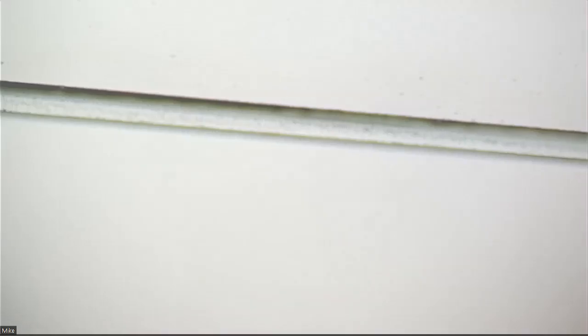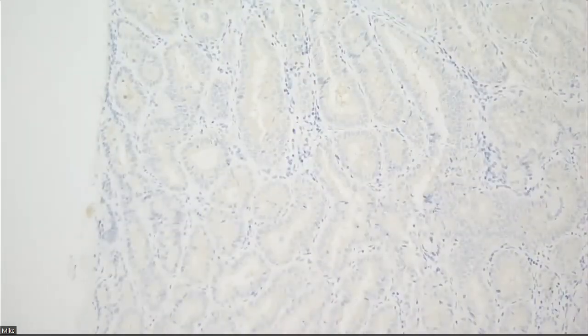How do they treat them differently? They'll definitely be a little bit more aggressive. They'll definitely do completion with high dose radioactive iodine. What they might also consider is targeted therapy. So this is BRAF IHC in this case. And again, it's weak, but it's arguably positive right in this area here. So they may consider BRAF inhibitors. If it were an NTRK rearranged type of tumor, they may consider an NTRK inhibitor.